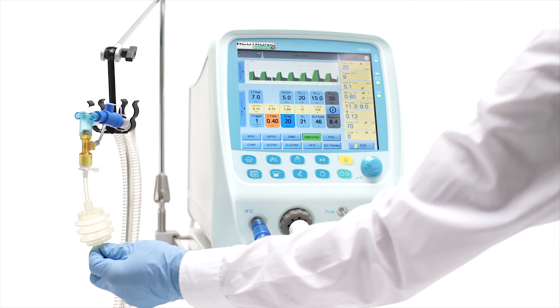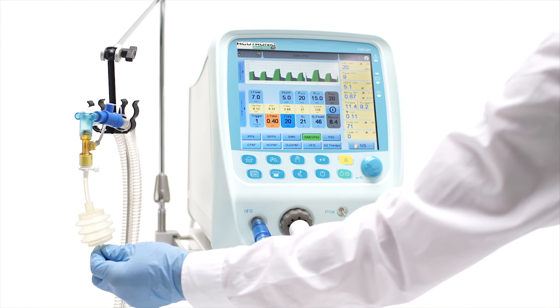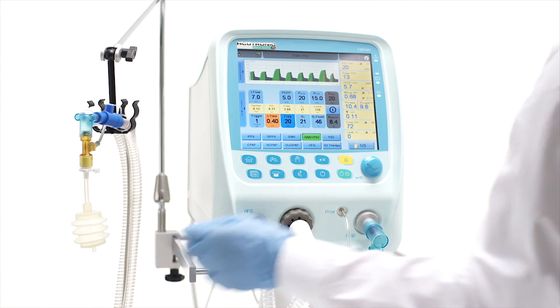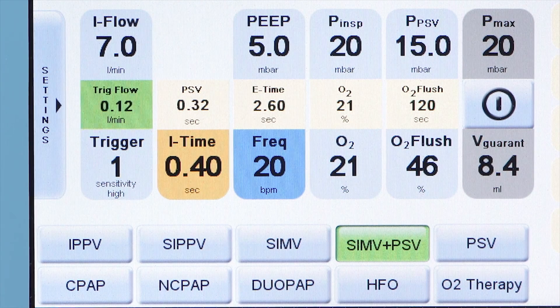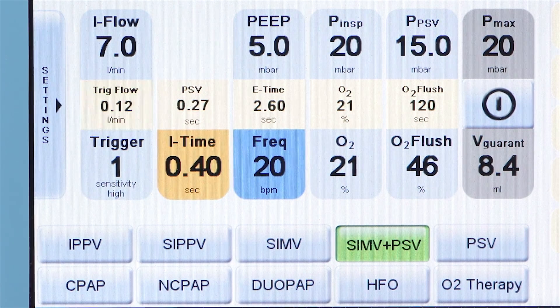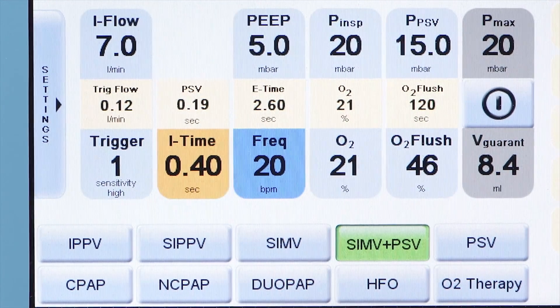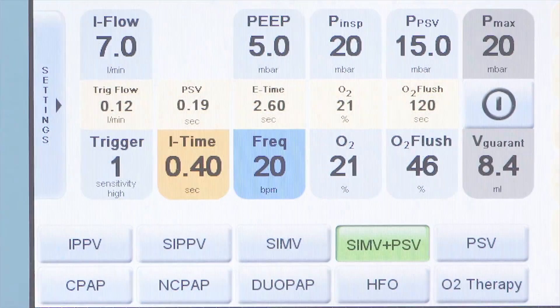The I-time also represents the maximum I-time for the flow-cycled PSV breath in case the flow termination criteria are not met. The PSV time is always displayed in the yellow window above the I-time button and may vary breath by breath.